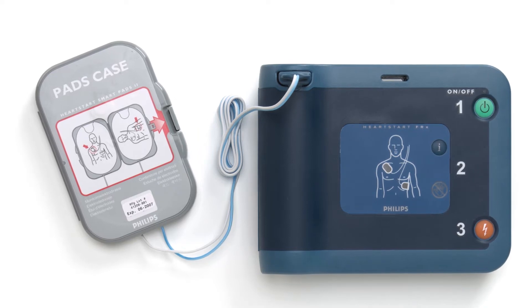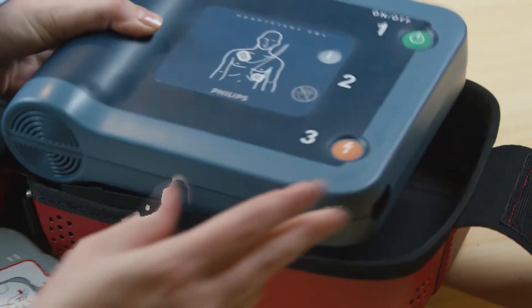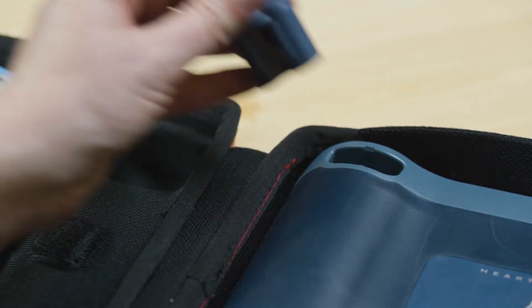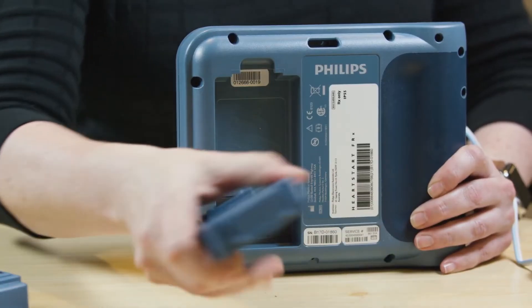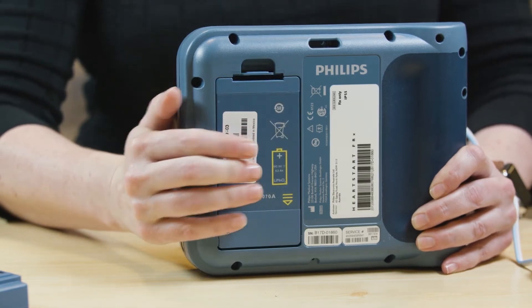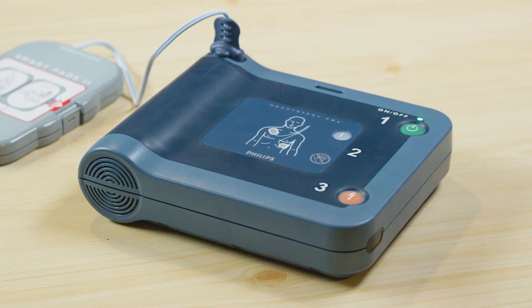To perform the initial setup, first remove the HeartStart FRX from its packaging. Then remove the smart pads from the packaging and plug the pad's cable connector into the connector point on the FRX unit. Next, open the battery package and place the battery into the battery compartment. Press firmly on the latch until it clicks into place. Then set the FRX and pads case onto a flat surface and allow the device to run its automatic battery insertion self-test.